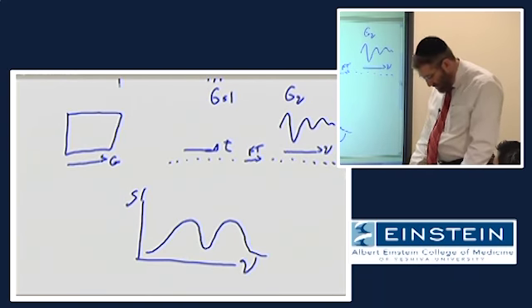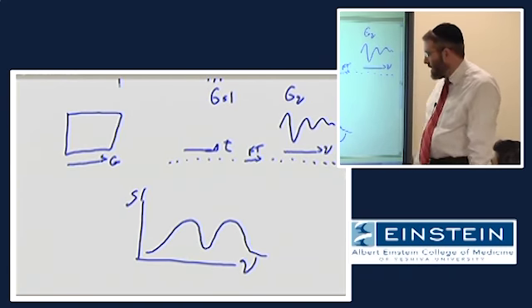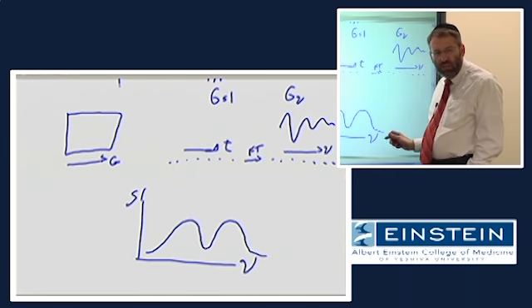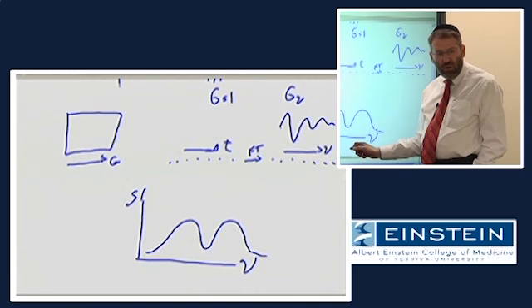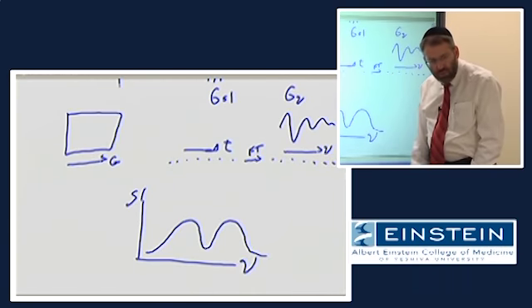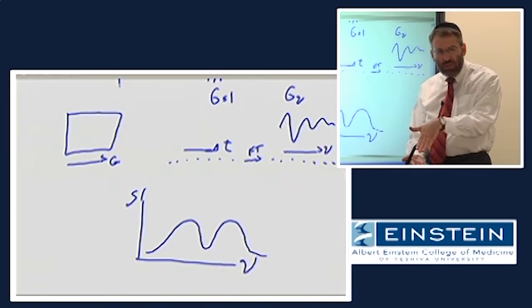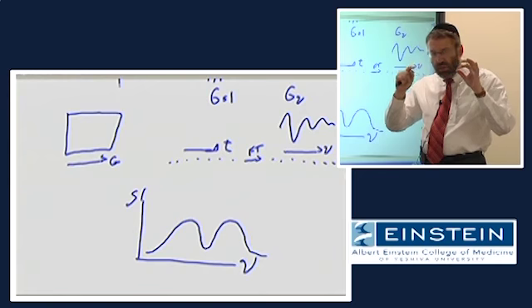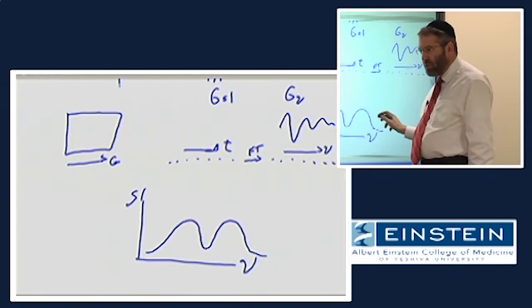So assuming the person's legs weren't exactly together, there's no signal outside. There's no signal between their knees, and there is maximal signal in the center where the tissue is the thickest. As you know, it's a round structure. It gets thinner to the sides, so the signal trails off here.